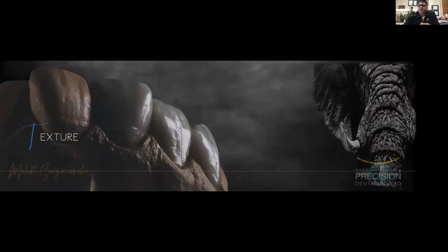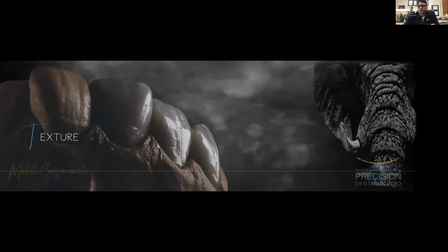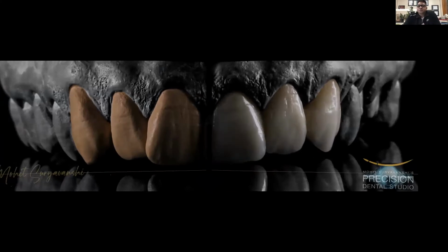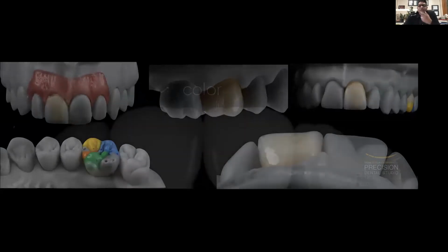You can have all possible optical views of what you're going to wax up, and then you can mimic it into your ceramics. Maybe it is a lithium disilicate or it is a layered ceramic. So Renfert plays such a vital role because it has eased our everyday working. It has given us so many materials and also so much equipment that life becomes really easy.